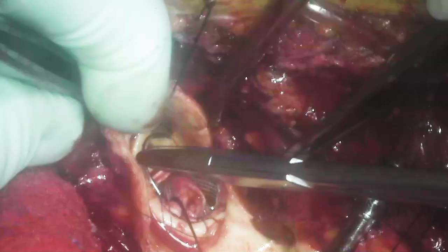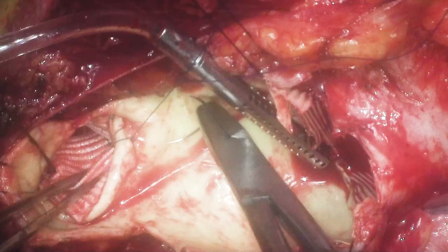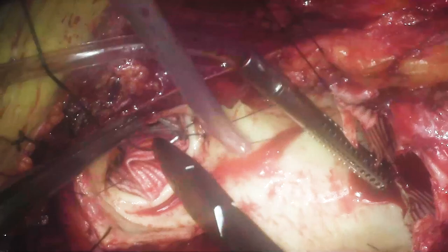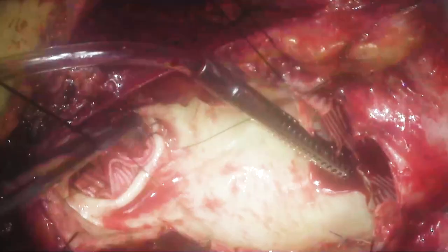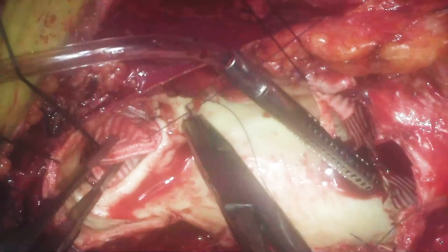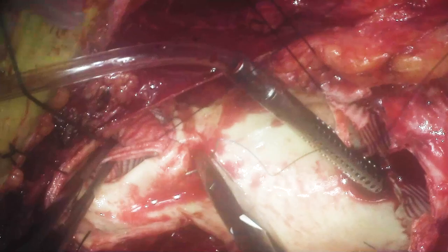Here's a critical part — sewing the left subclavian artery into position and making sure that it's not constricted. There are some critical pledgets in this operation that you're going to use to make sure you have good sealing. Now we're moving clockwise around the rest of that anastomosis. This is not entirely a flat anastomosis — you want to have a fairly good-sized anastomosis without constriction of your inserted elephant trunk. We'll go through stages of stretching this anastomosis, as you'll see in a while.